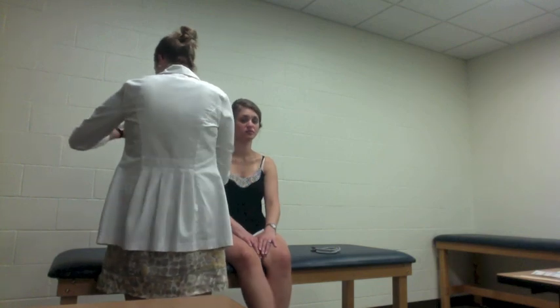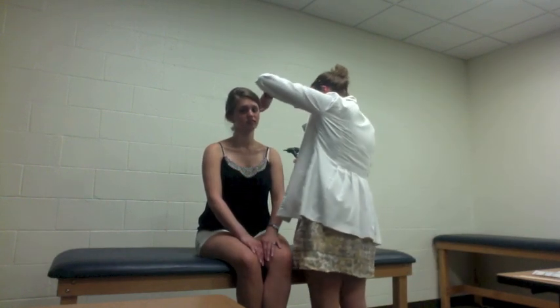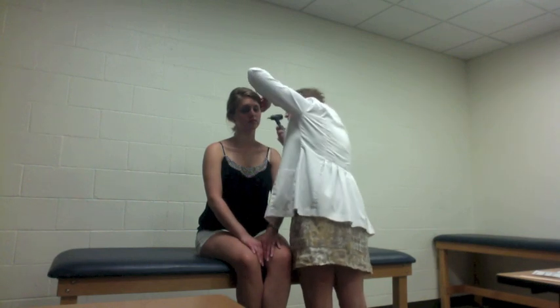Okay, perfect. About the same. Twice as long, so that is a normal finding. Okay, and let me know if I hurt you or if I go in too far. Okay, I'm just gonna pull back, and then I'm gonna inspect your ear canal as I insert.